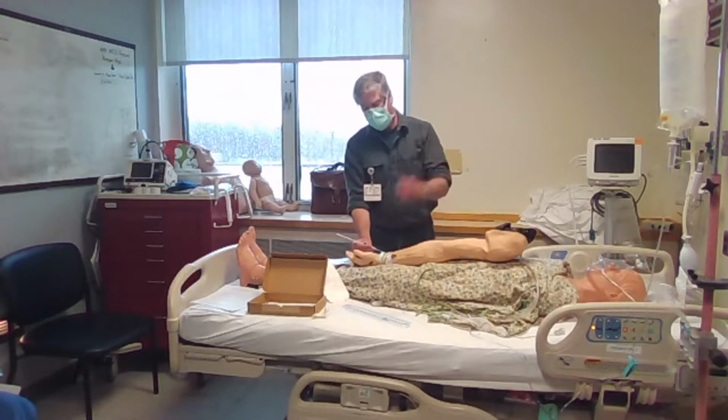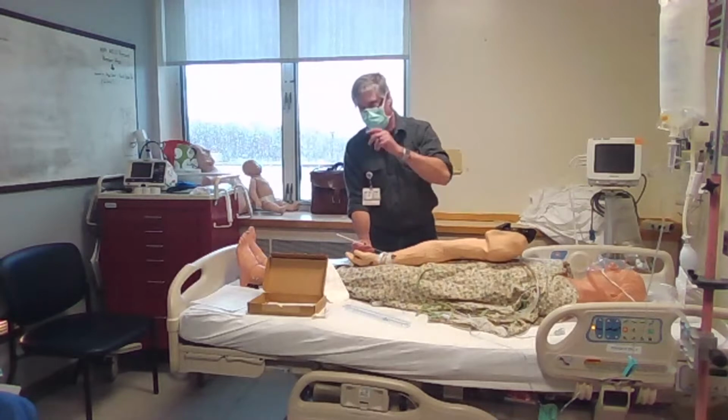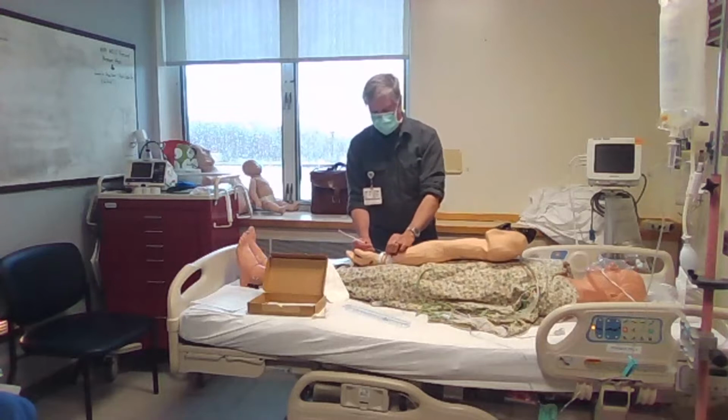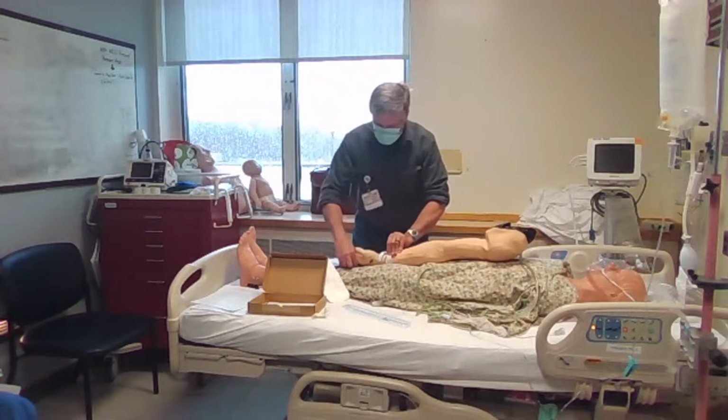And if it goes in smoothly, then you can twist the catheter off. Twisting just makes it easier when it goes through the skin because the catheter is bigger than the size of the hole that the needle made. So it holds on to the catheter. And then you put pressure, take it off, set it aside because it's contaminated.